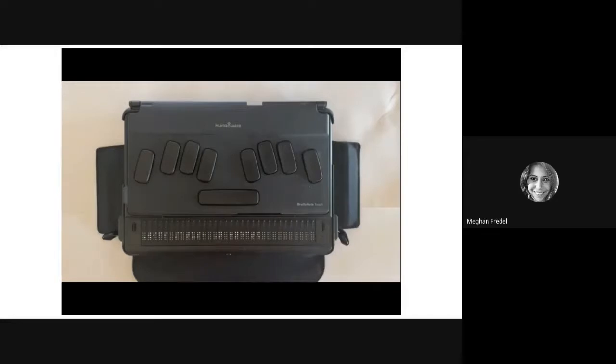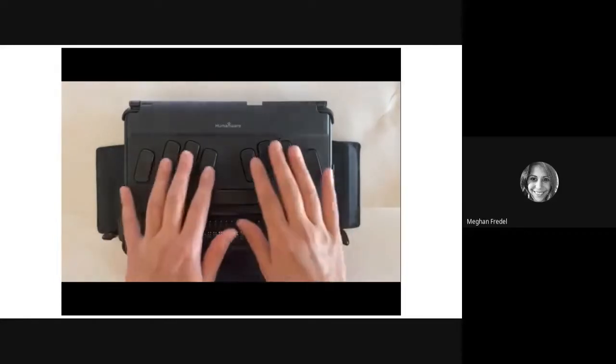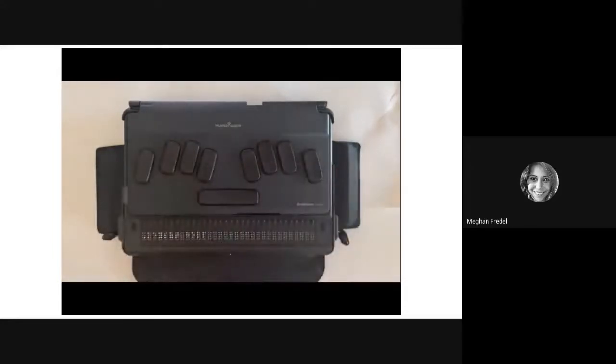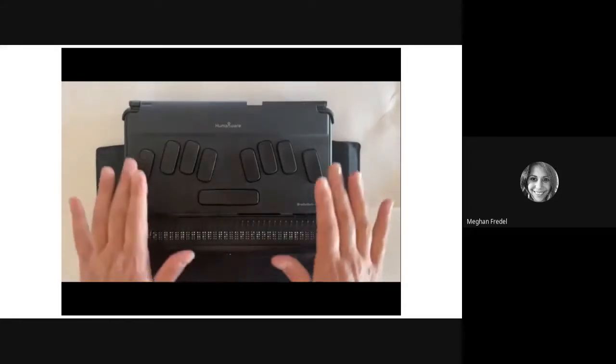And then next, to get context-sensitive help, which means if I'm in, say, word processing and I need help, this is how I can get help within that program. And that's simply a space plus H. Key soft help. To quickly jump to an item.